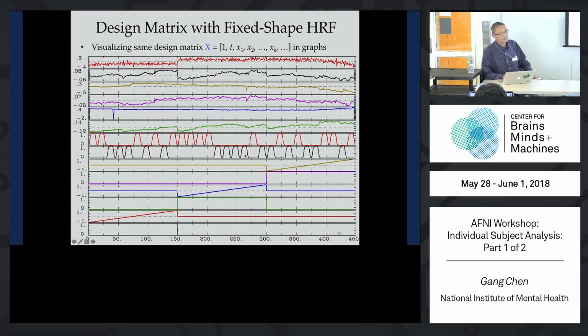And you pull out that baseline from your data, you do a low pass filter and see what that drift is, or you do a linear fit to the whole thing? We do a linear fit for each run. In this case, I don't remember, probably 200 seconds, but yeah.